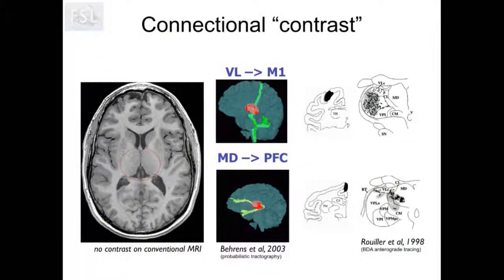So let's take a T1 weighted axial slice, like in this case, from a subject. Beautiful contrast, very high resolution. But if you were to segment, if you were to extract the bilateral thalami, so the left and right thalamus, it becomes quite tricky, right? You have a very low signal to noise ratio, specifically in that area.